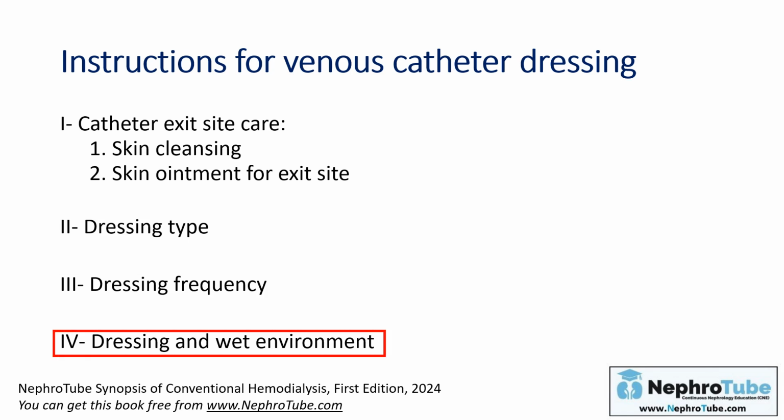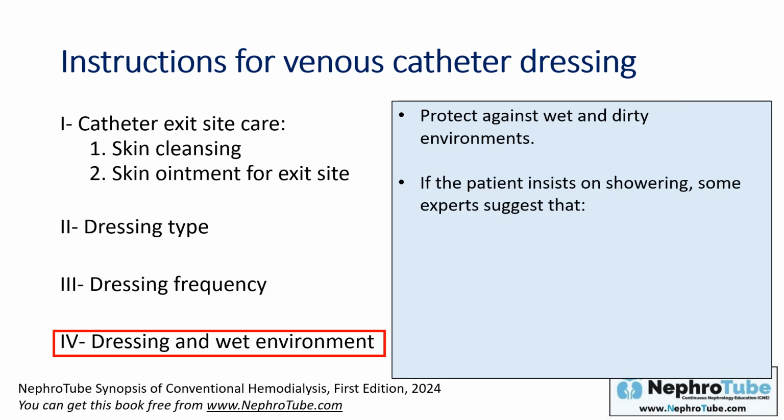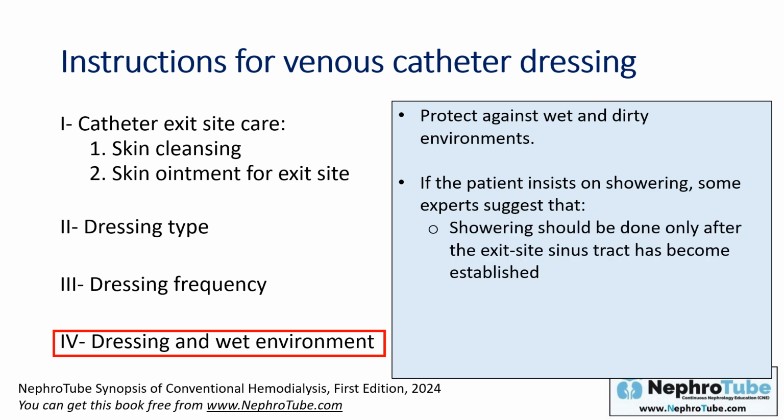Regarding dressing and wet environment, KDOQI mentioned that the dressing should be protected against wet and dirty environments, but if the patient insists on showering, it's better to do the following.